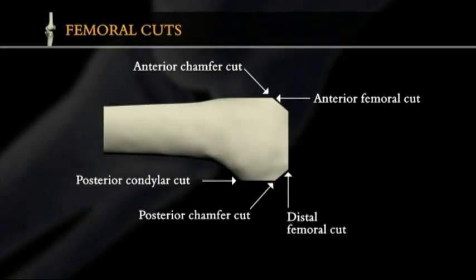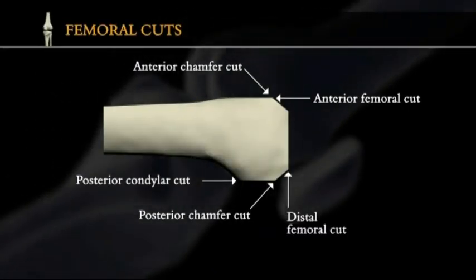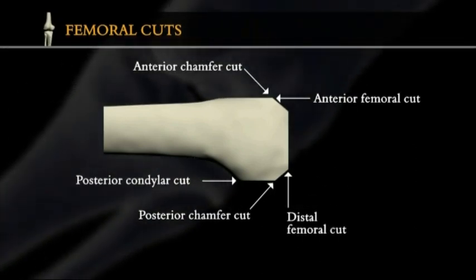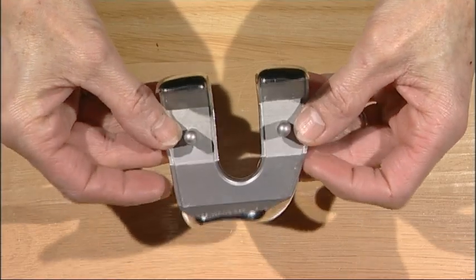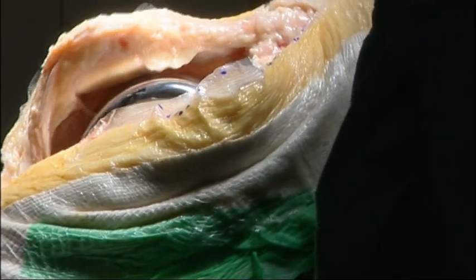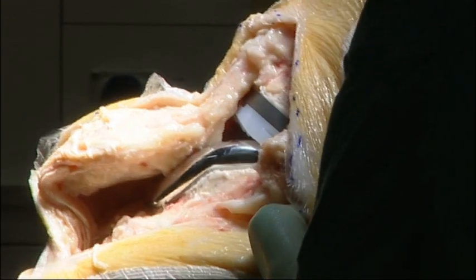But as the knees became more and more complex, it was clear that in order to get the benefits of a modern type of knee replacement, you had to plan the operation, and the instrumentation had to become much more complicated than the early ones. The 5 basic femoral cuts were first described by Hungerford in 1981 in the porous-coated anatomic, the PCA knee. In the last 20 years, modularity and revision systems have been introduced, but the basic design for primary TKR has changed less radically than during the previous decade.